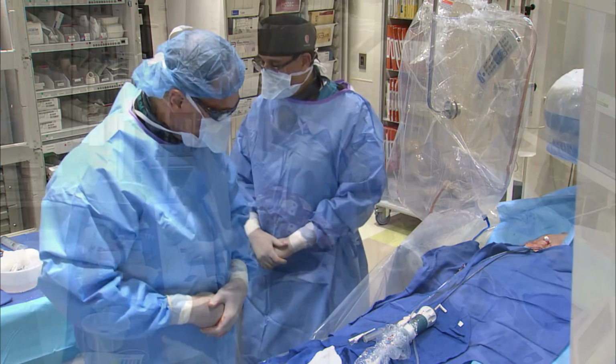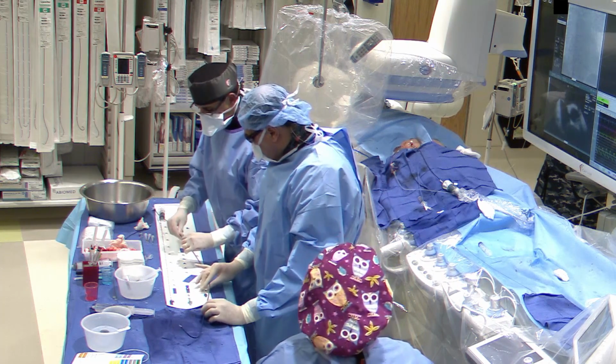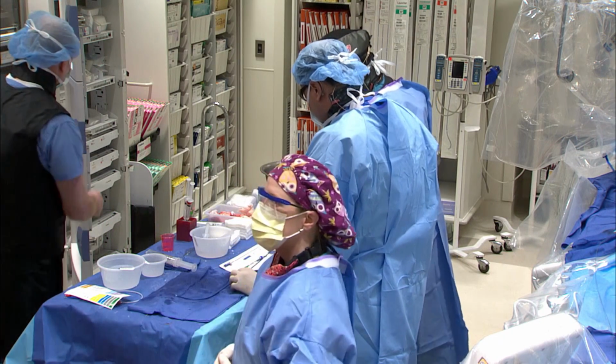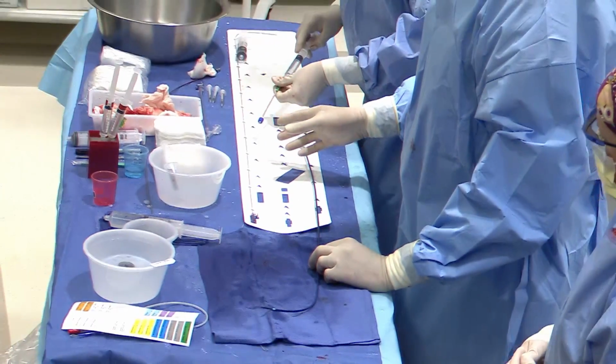Here, this is the Amplatzer sheath. This is a curved sheath. There is a dilator that comes with it. We flush the sheath, and Andreas has put the dilator through it now. This is the thing that's going to go in there. There are two other pieces with this kit.